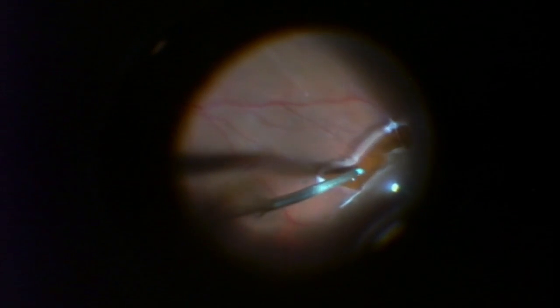You can see that the blue tip is caught on the edge of the retina there. I'm actually pumping in air as I'm aspirating or sucking out fluid, and this will actually reattach the retina. This stage is pretty critical because you need to get all the fluid from underneath the retina so that when we eventually do laser in just a few minutes, the laser will take hold. Laser does not work on detached retina, so my goal right now is to remove all the fluid from underneath the retina.